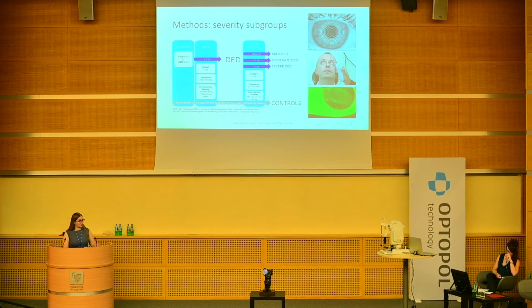And we also had to put our subjects into groups, and this is when it started to get a little bit tricky, because I already told you that the protocols are pretty heavy to diagnose dry eye itself, and what's more, to diagnose each level of dry eye disease. And we used the aforementioned Dry Eye Workshop 2 report to diagnose it. It's usually based on 3 markers, which are called the markers of homeostasis, which is the NITBUT, or non-invasive tear film breakup time, tear osmolarity, and the staining of the ocular surface with fluorescein, plus the symptoms.